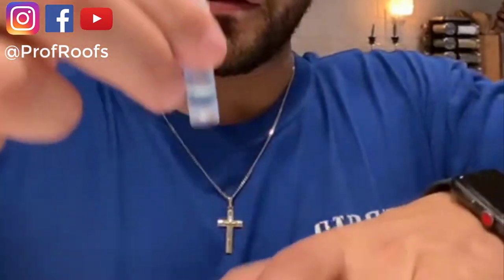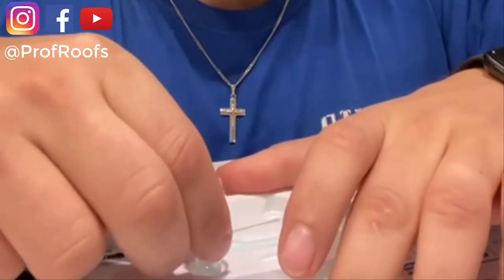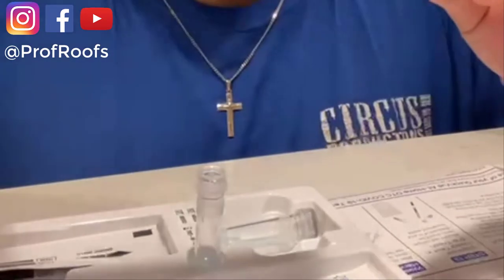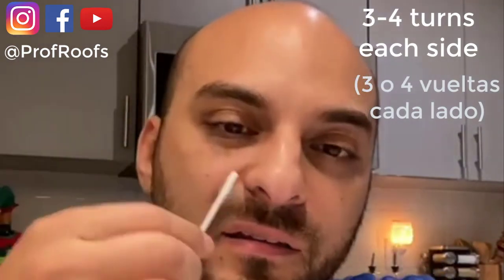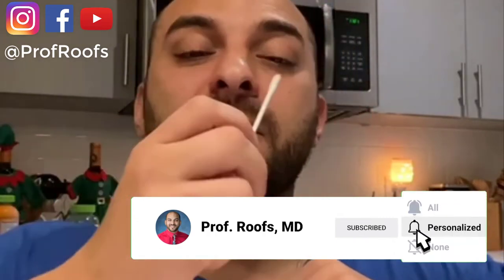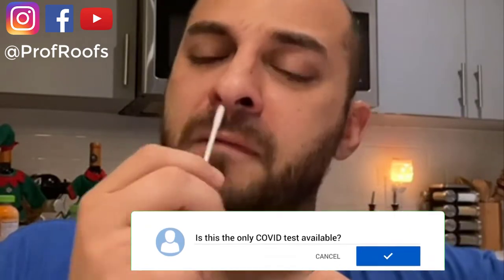Okay. And the tube with the fluid, okay, con el líquido, lo metas acá. And then, después, I'm gonna take this, zapalito, lo vas a abrir. Como tres o cuatro veces en cada nariz, ¿cuánto nariz tiene? Right? Every side of the nose, cada lado, ready? Uno, dos, tres, y voltearlo, cuatro. Quiero estar seguro. Uf. Uy, otro lado. Uy. One, two, three. All right.